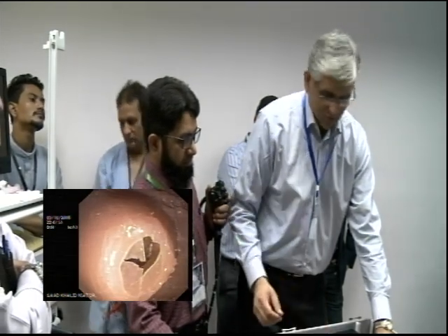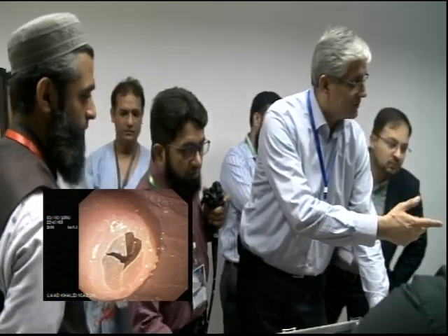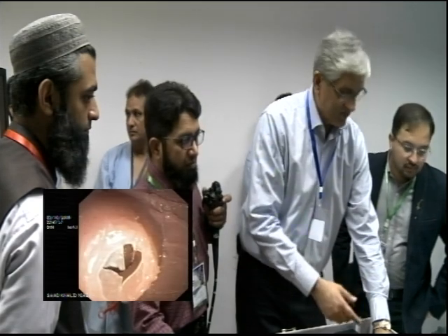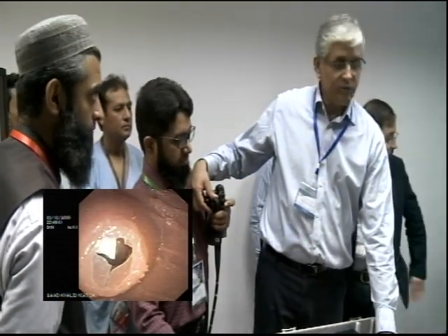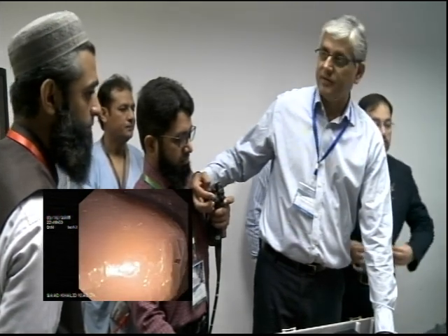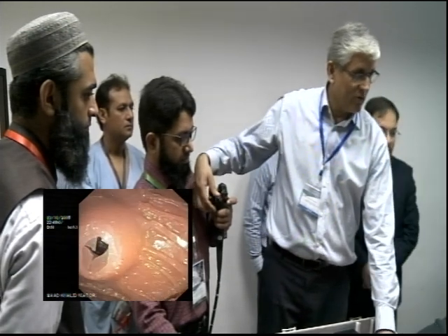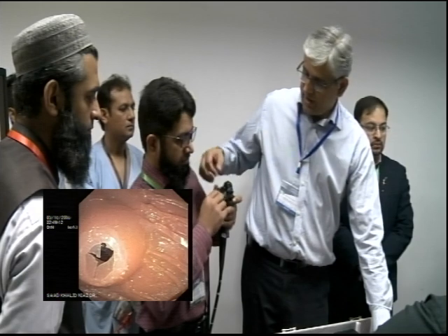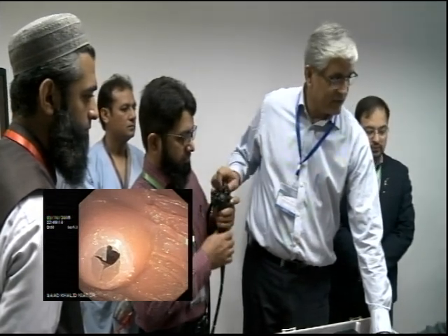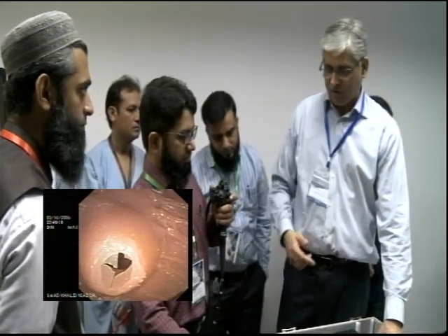This is what you were saying, how close I want it. I would be pretty happy with this position, even a little bit more straight if I can use the big wheel and the small wheel. Now if you want to lock it here, I have no problem, so you can lock it here and you can lock this also. This is a pretty good position, and I'll keep my finger there because that's where I want it.